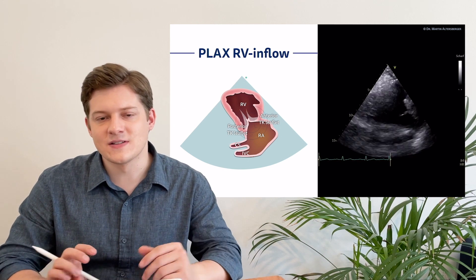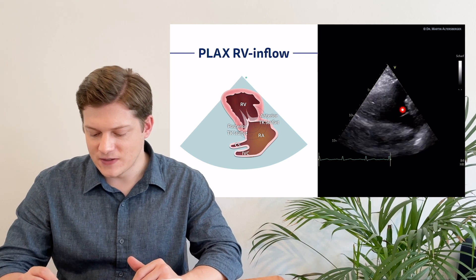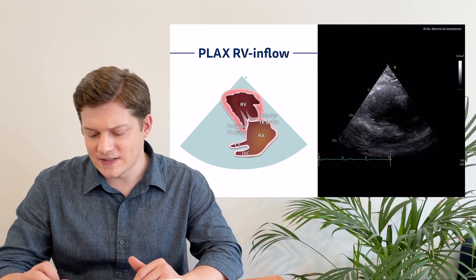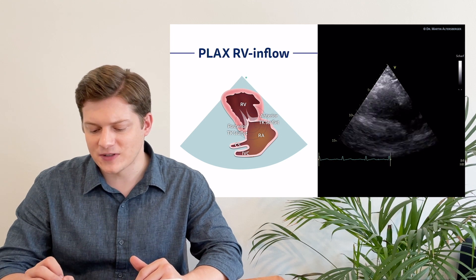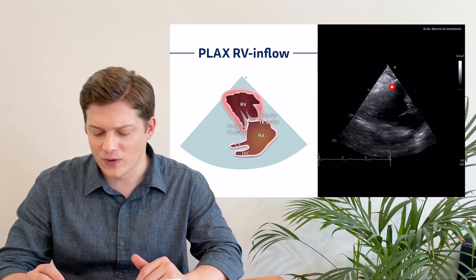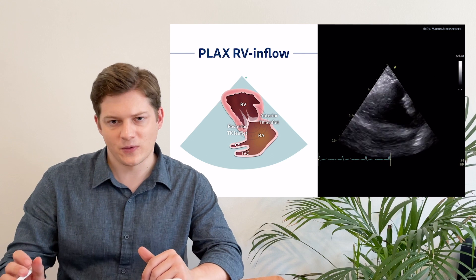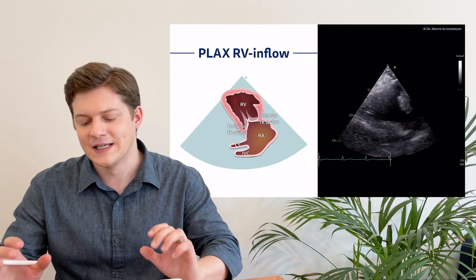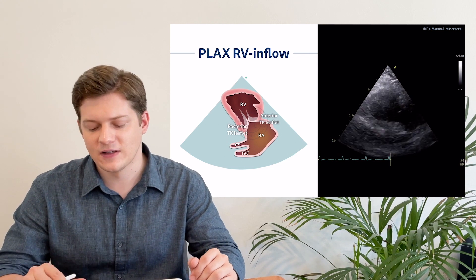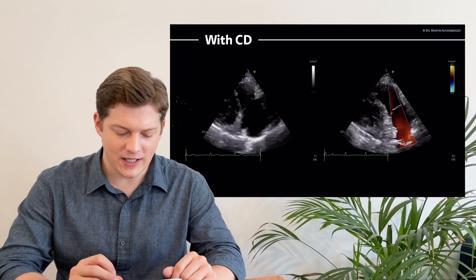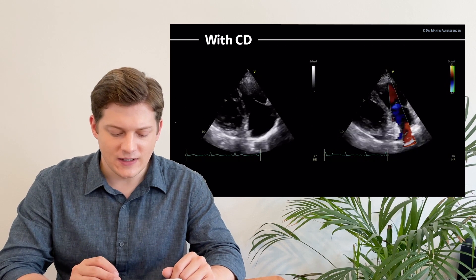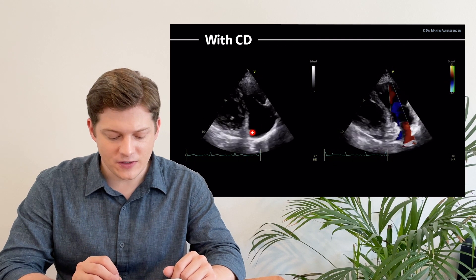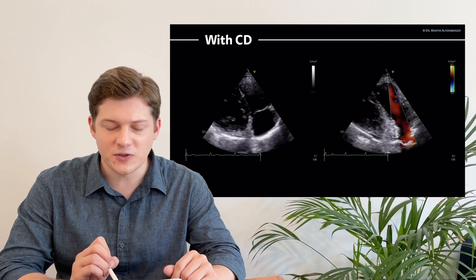Sometimes the view doesn't look that nice — it can also look like this, where you still see the tricuspid valve with the anterior and posterior leaflet, the right atrium, and the right ventricle to a certain degree. We can also differentiate the free wall of the right ventricle somewhat, but the image quality is reduced. Still, the information we get can be crucial. Adding color Doppler — back in the B-mode image — we can visualize the anterior and posterior tricuspid valve leaflets, the coronary sinus, the IVC, and the right atrium.